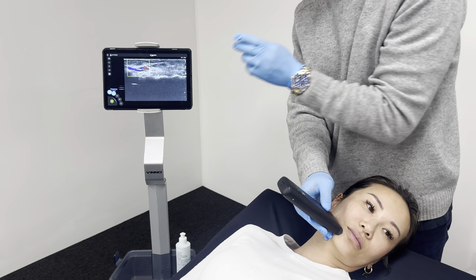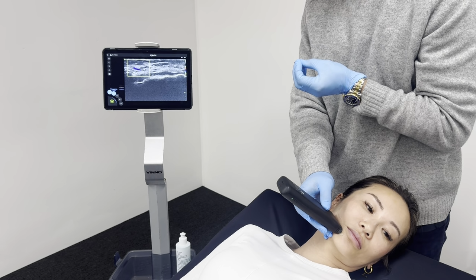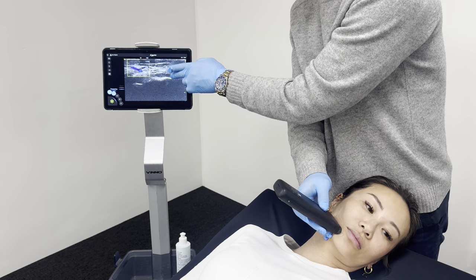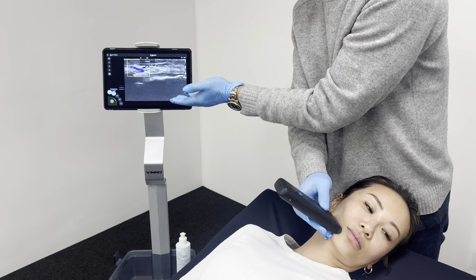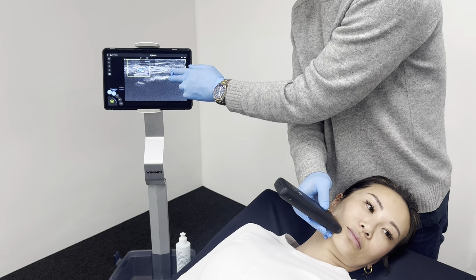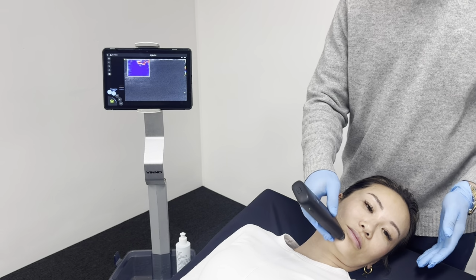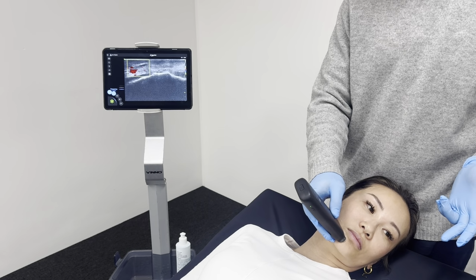So it's 6.3, and you can adjust the PRF, which means pulse repetition frequency, but basically what it's looking for is changing the speed of flow that it's detecting. So if I decrease my PRF, it's going to be more sensitive to lower flow, and I decrease my PRF by swiping up on the screen. So for the face, you usually want around about, let's have a look, 1 kilohertz is usually pretty good. There we are. So that's lower face. We've seen masseter, we've seen the parotid gland, we've seen the DAO, DLI.